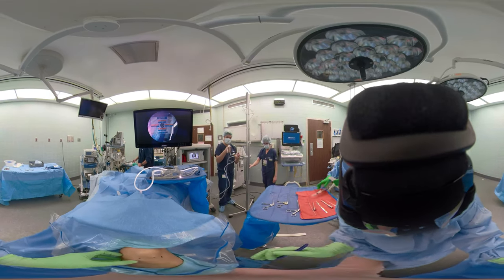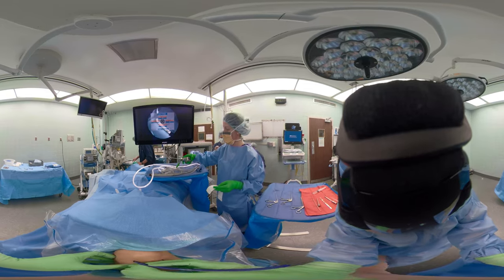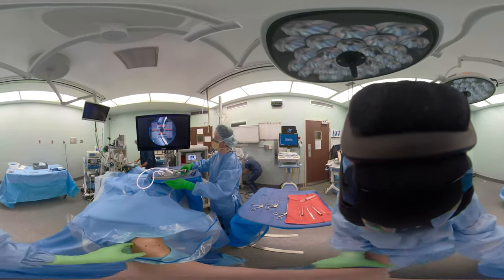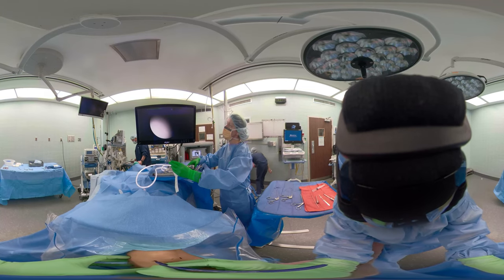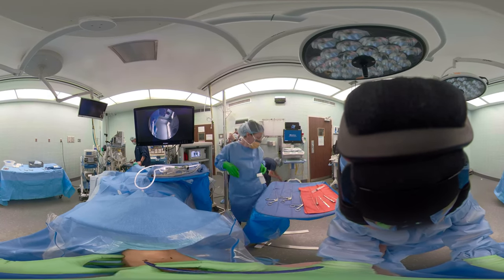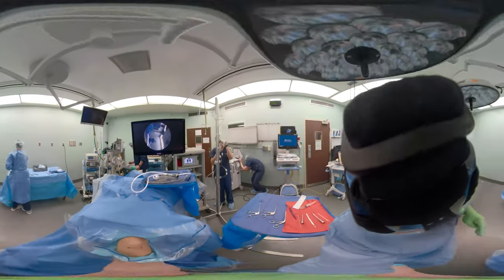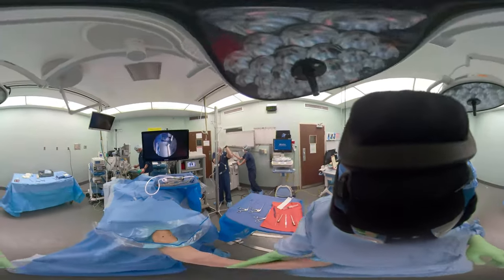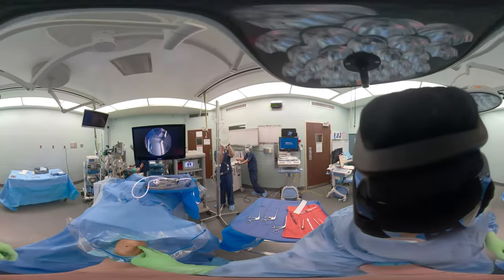The drape is completely done. The arthroscope is set up on the Mayo over the patient's body and we're making marks. We make our marks at 30 degrees of flexion, just lateral to the patellar tendon, which is where we'll put our scope in. Our portal is going to be at the inferior pole of the patella, just lateral to the patellar tendon.